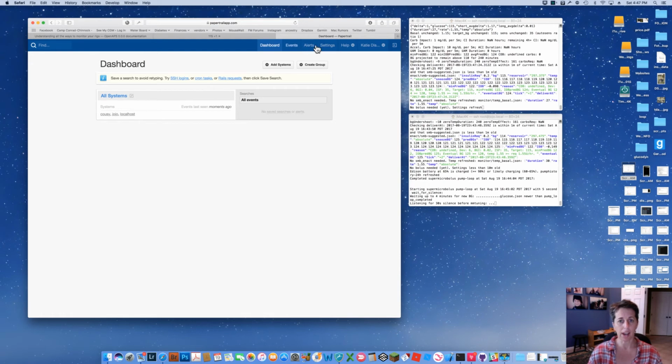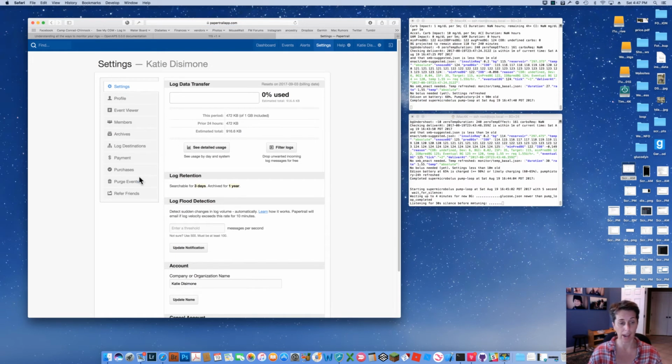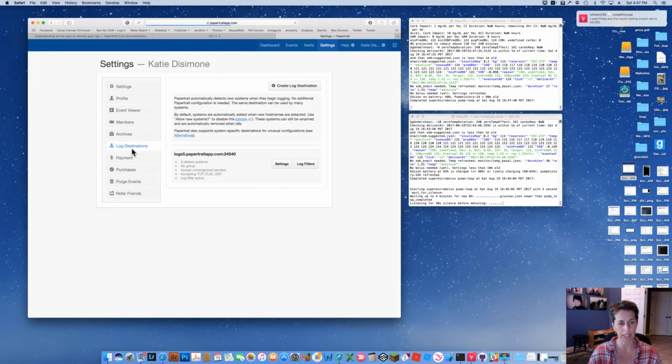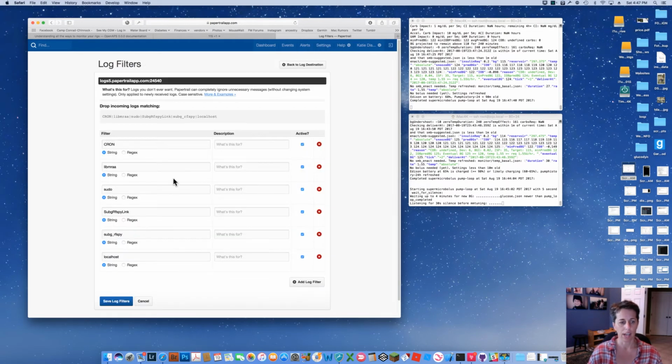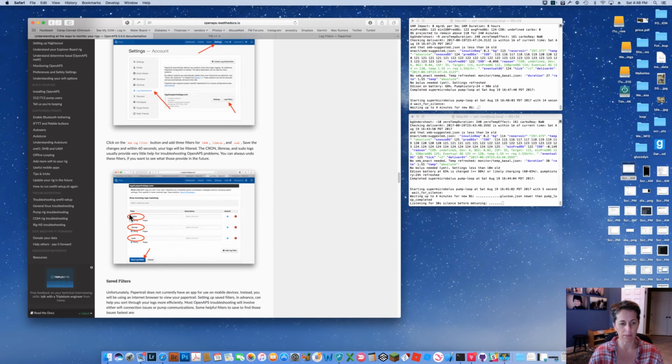So that's one thing. The first thing I recommend doing is setting up a filter. You're going to want to set up what they call an account filter, and basically you're going to go to log destinations under your settings. You're going to go to log filters, and you're going to set up things that you don't want coming in. So it's underneath here. There are examples for setting this up. There's instructions. You're going to want to add some log filters.